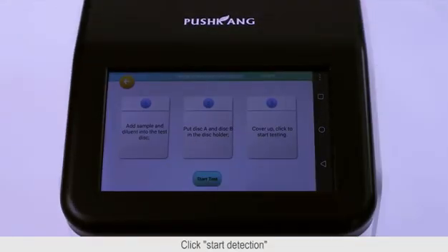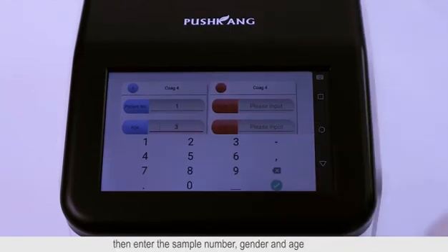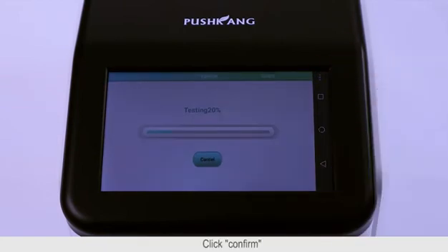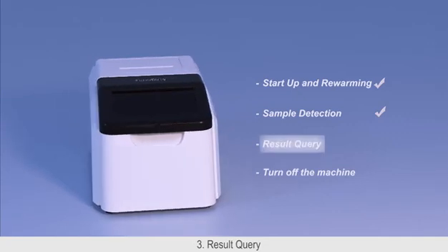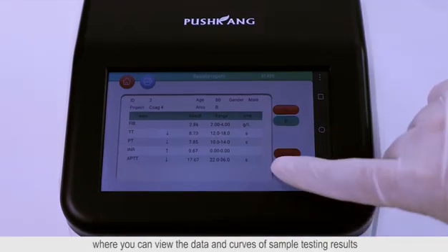Then close the cover and click Start Detection. A prompt will appear: please input patient information. Enter the sample number, gender, and age, then click Confirm. The machine starts sample detection. The machine will directly pop up the result report, where you can view the data and curves of sample testing results.